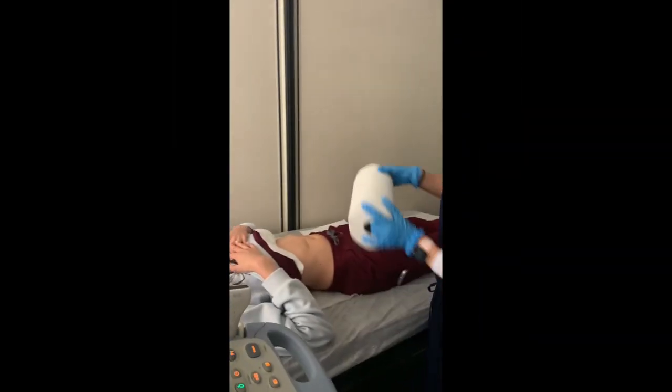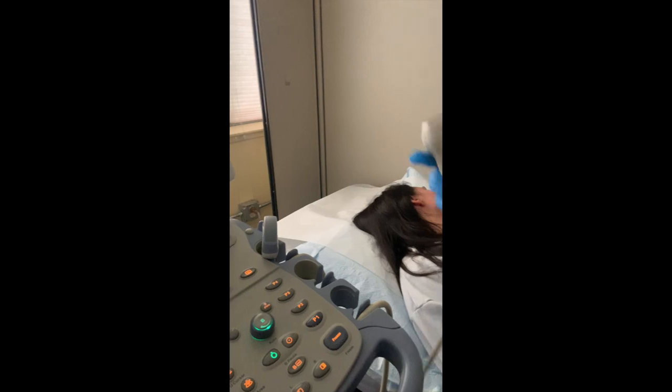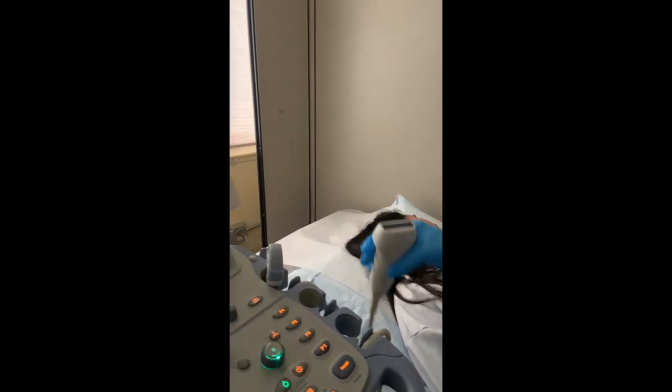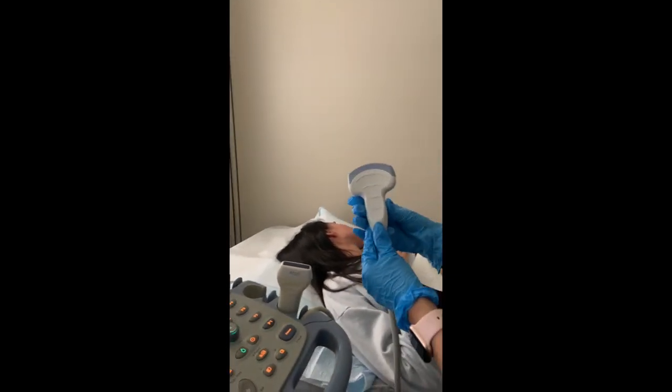Once the patient is ready in their supine position, prep them accordingly and remove items of clothing covering the area of interest. You want to always use the correct transducer for your exam. This here is a linear probe, and the one that we will be using today is a curvilinear probe.